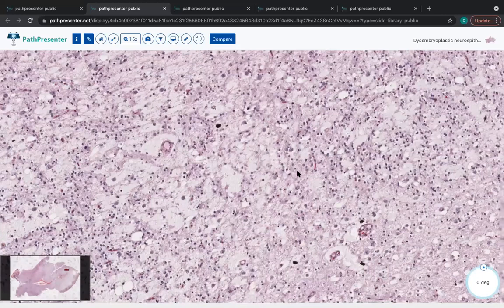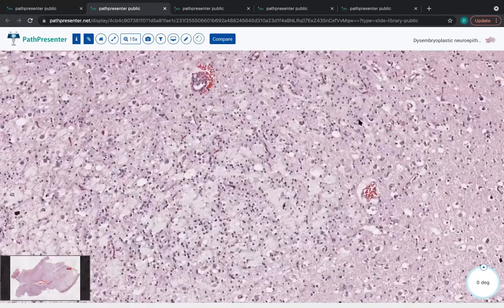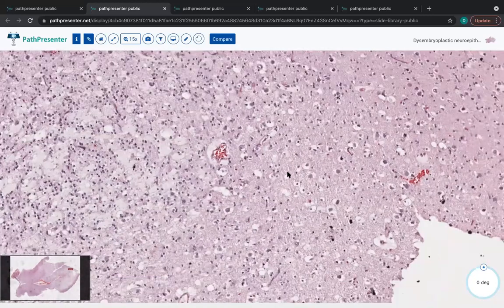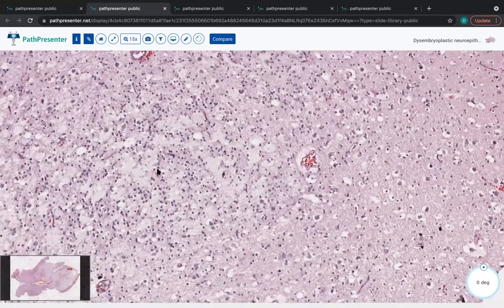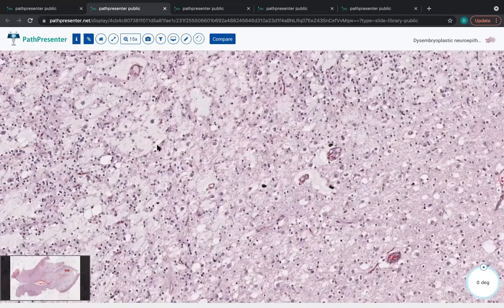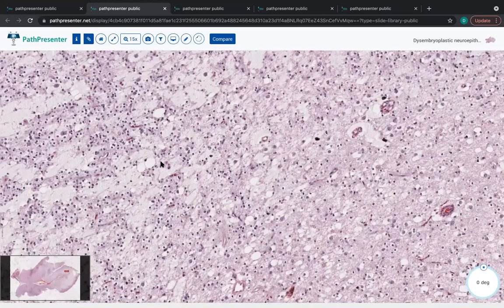But that's not the only mutation that these tumors can have. And there's many other tumor types with other alterations that can have this kind of cortically based oligodendroglioma-like morphology that don't as of yet have good names. So this is just one in the spectrum of tumors that can look like this. The very indolent Ki67 in these tumors would be extremely low, maybe 1-2%.